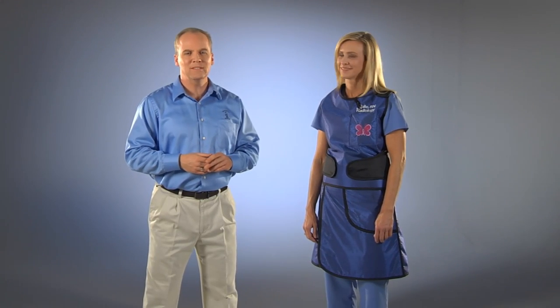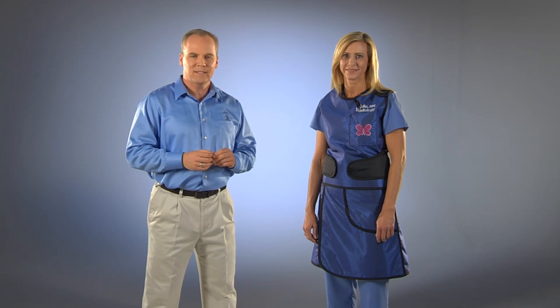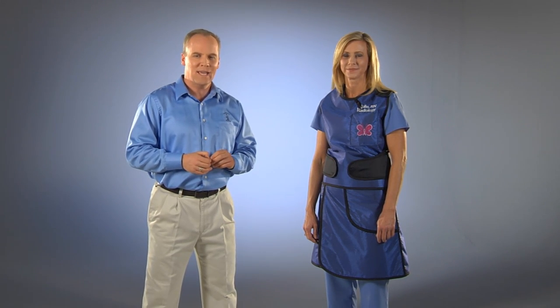Hi, this is Bill and Julie from Burlington Medical. In this video, we are going to go over the Peak Vest and Kilt Front Back X-Ray Apron.